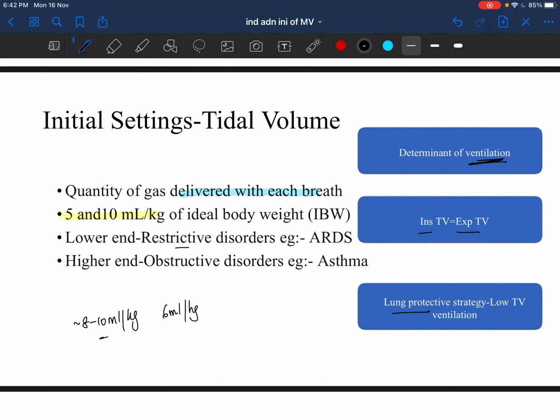I want to discuss respiratory rate before getting into the explanation about ventilation. So the inspired tidal volume, this is the inspiratory tubing, should be equal to your expired tidal volume. Suppose the tidal volume during inspiration is more. So in between there is some amount of air that is lost, right? So you must suspect a tube leak or a circuit leak.